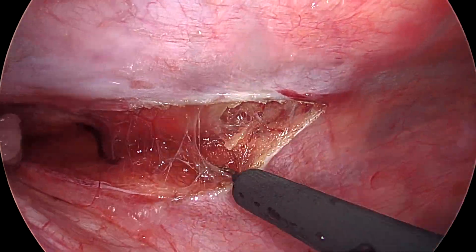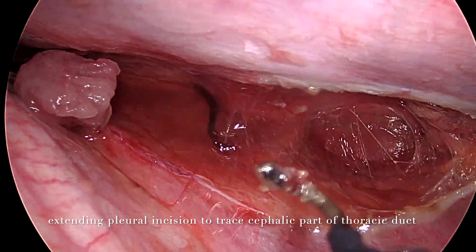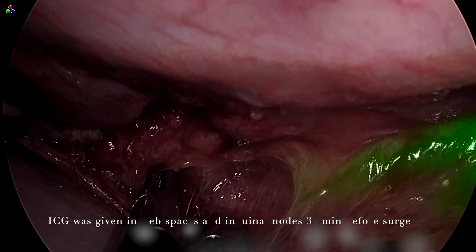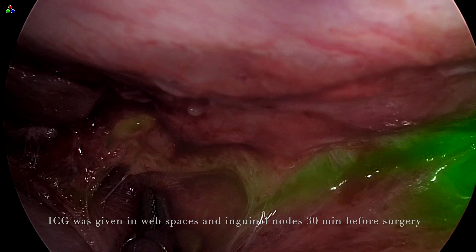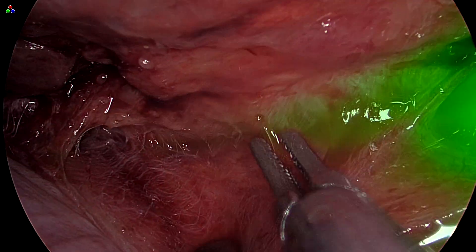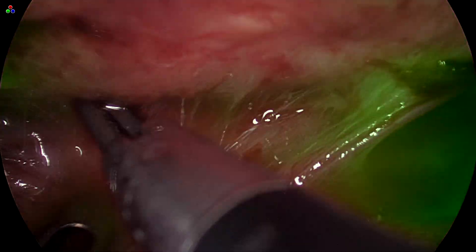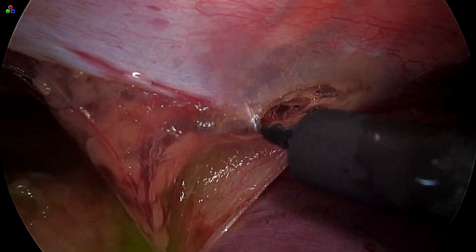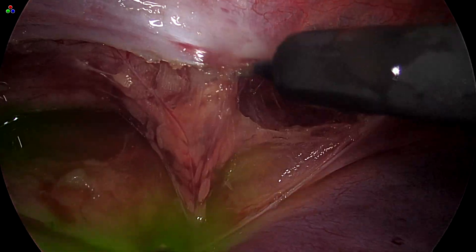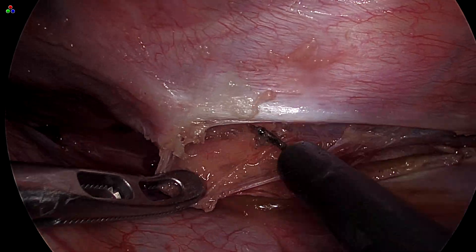We are extending the pleural incision to delineate the proximal and distal ends of the thoracic duct. ICG was given in this patient in the web spaces and also in the inguinal region. However, it was not of much use in this patient. The mediastinal pleural incision is being extended to trace the proximal and distal parts of the thoracic duct.